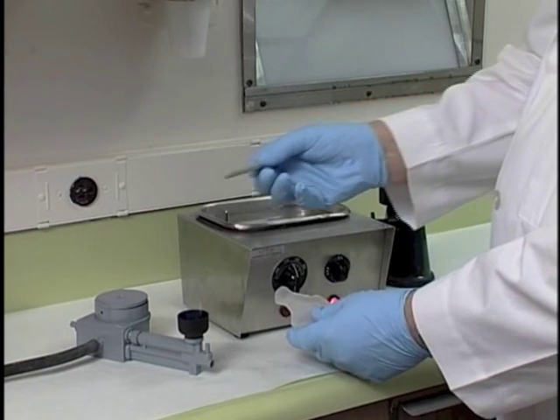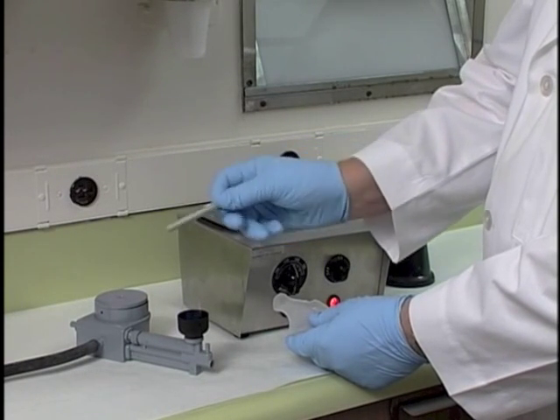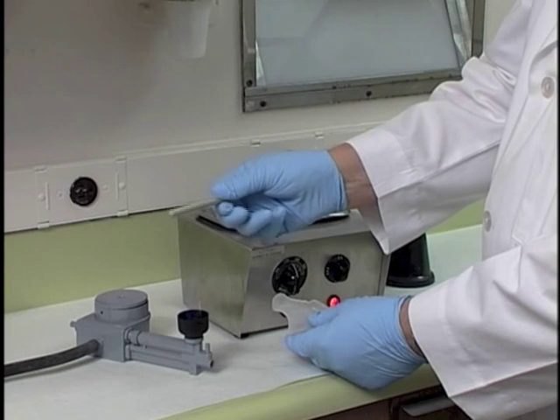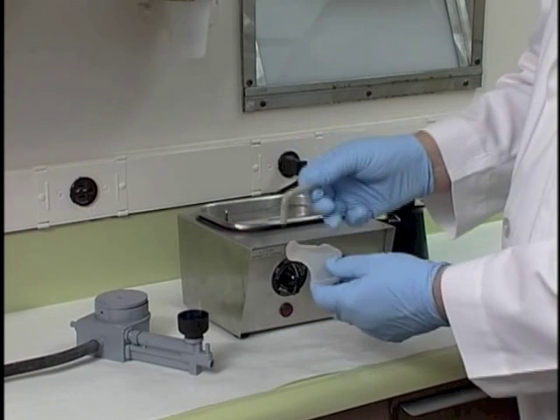So what we're going to do is soften this compound by constantly rotating the material just over the flame. And we'll get that material very, very soft to the point to where it actually looks like it's going to drip. And it'll get very, very soft. If you get a little bit too much heat, you'll see that happen to it, but that's of no consequence.